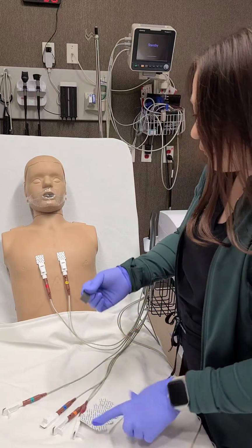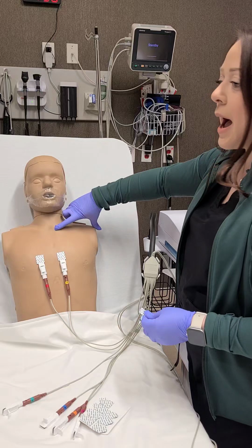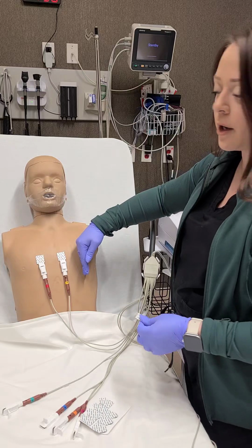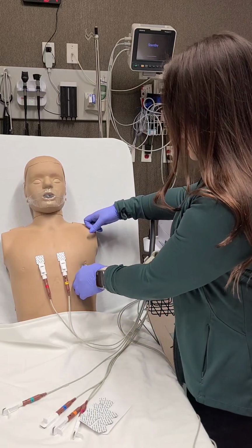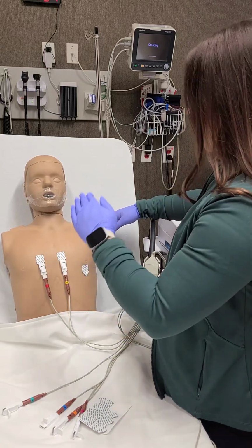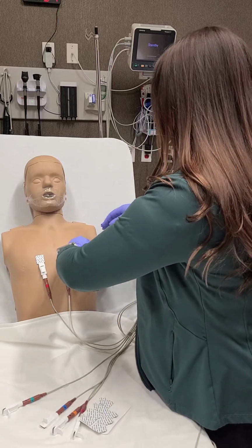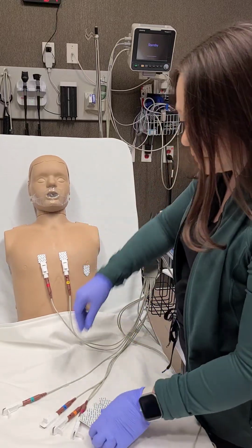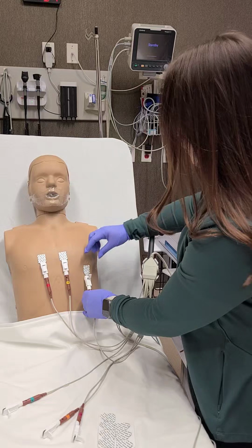Right there. Now go ahead and skip V3 because there's no anatomical location for V3. Go straight to V4 at the mid-clavicular line all the way down to the fifth intercostal space. It usually lands at the nipple line for men. If you have a female patient, go ahead and use the back of your hand to gently lift the breast up so you can get as close as you can there to that fifth intercostal space. That's V4.